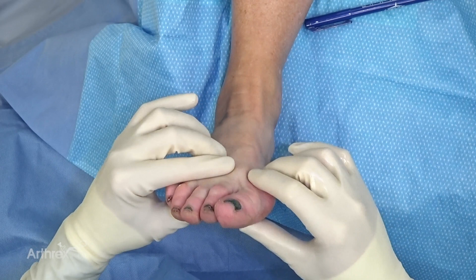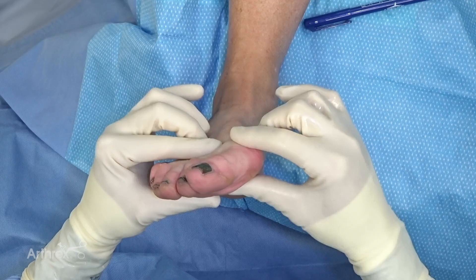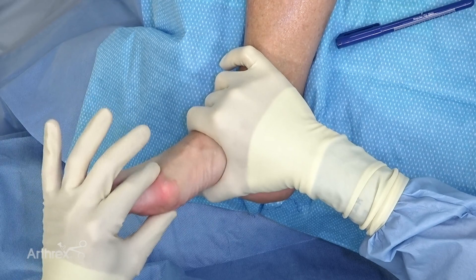So this patient, one of the reasons we're considering a lapidus for her is not only the large IM angle but also the amount of hypermobility. If you compare this, you see a lot of excursion and play. I like to hold the midfoot and also demonstrate isolating the first TMT joint. You can see she's very loose.